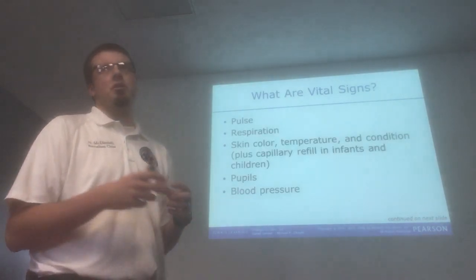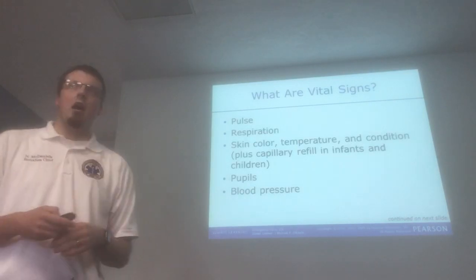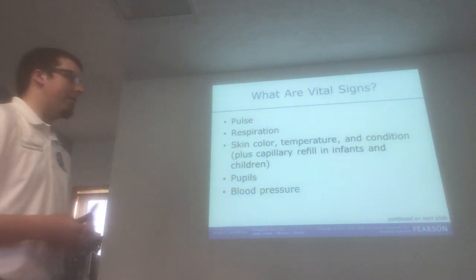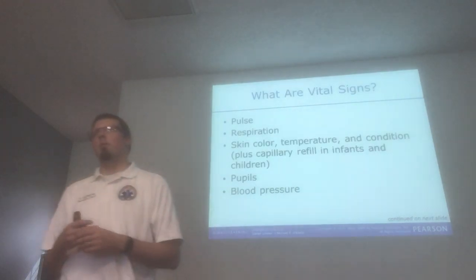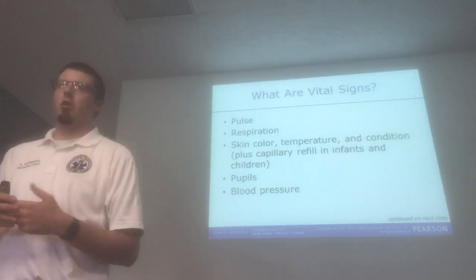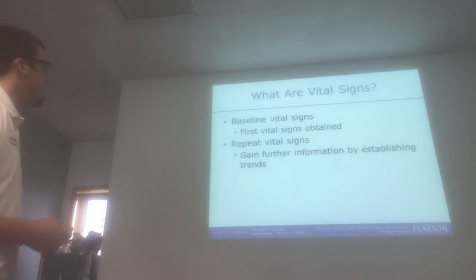Blood pressure is another very important vital sign. We get it on pretty much every patient. And once again, like we've talked about, if you don't know what you're hearing, then don't report it. Don't just make up a number. That can be hugely detrimental. If you're not sure, just tell your partner you're not sure, and we'll go from there.